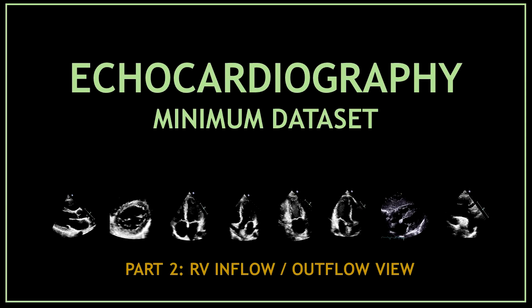This is the part 2 of a series of videos I'm going to do about the minimum dataset you need to obtain in order to perform an echocardiogram. In this video, I'm going to show you all the minimum dataset you need to obtain for the right ventricular inflow and outflow views.